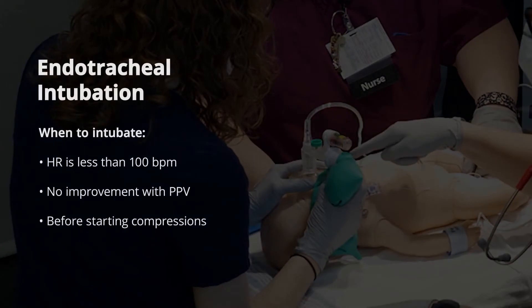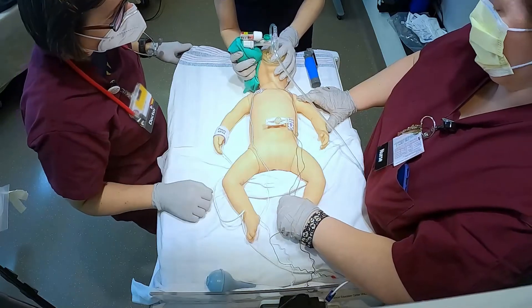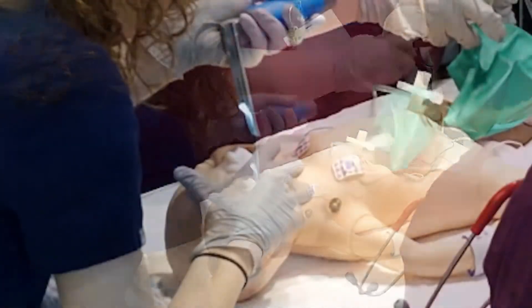Endotracheal intubation is recommended when the heart rate is less than 100 beats per minute and not increasing with PPV. It is also recommended before compressions are started. Everybody ready? Start whenever you're ready.